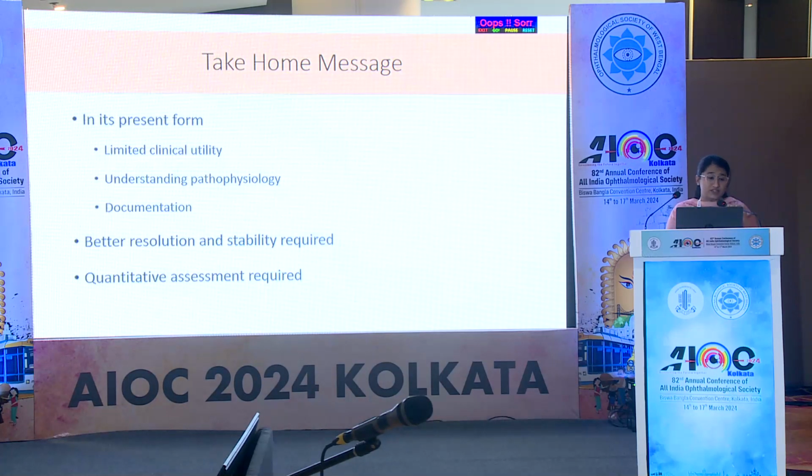So the take-home message from this is, although IOCT is useful, it has limited clinical utility as of now. We can understand pathophysiology of multiple diseases through this. It can help us document in our routine clinical practice, but we do require better resolution and stability.